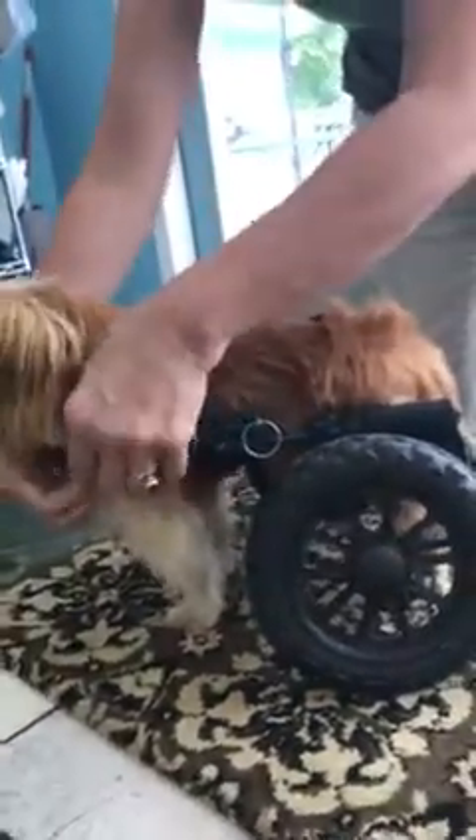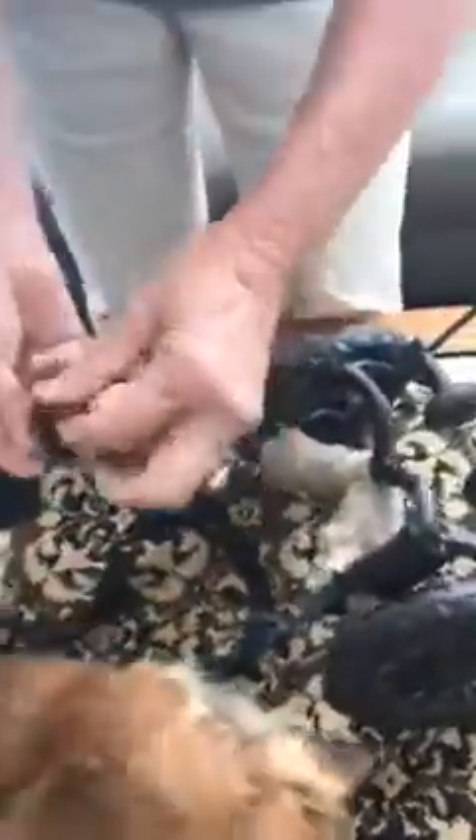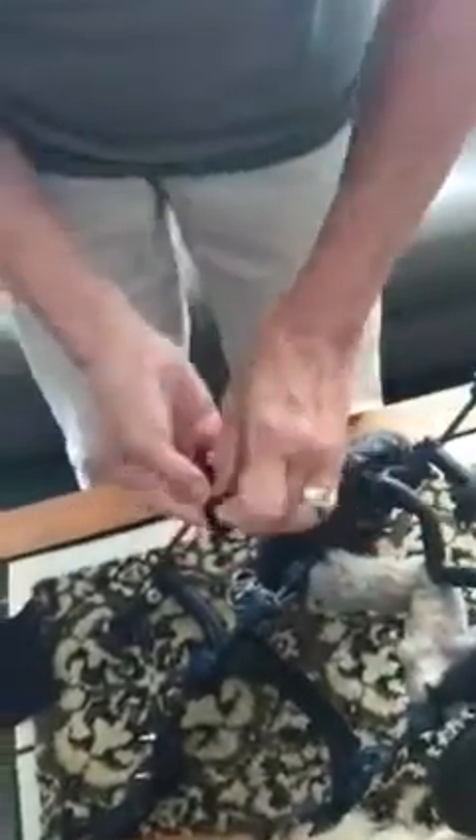Then I suggest you take the dog out again, put your velcro locks on, and put on your neoprene cover. If you've done this once the right way, you never have to do it again. Take your velcro lock — it's a little tee of velcro — slide the tongue over, then bring the sides around to lock it in place. Put your neoprene cover back on and you're all set.